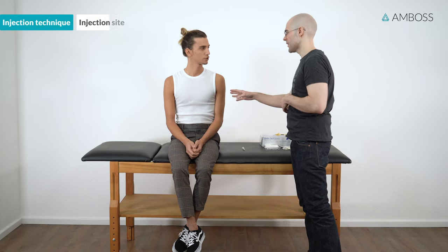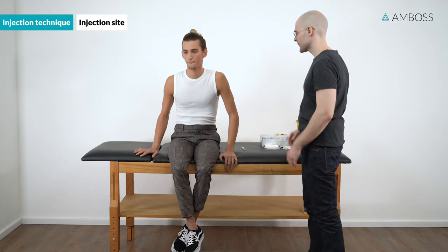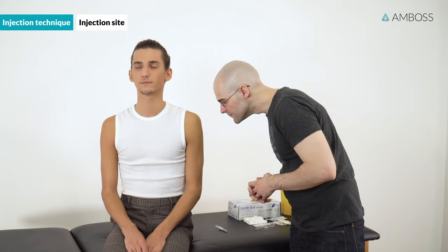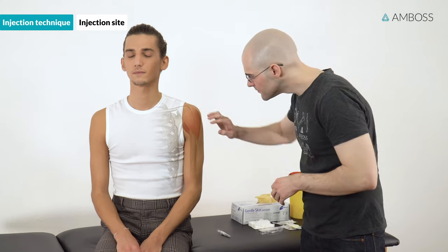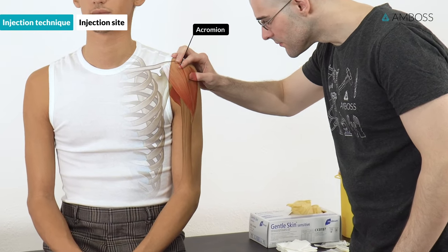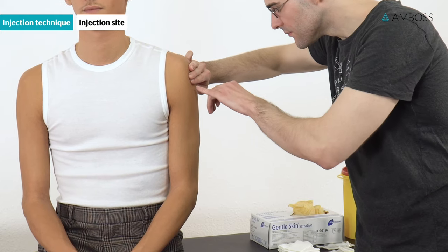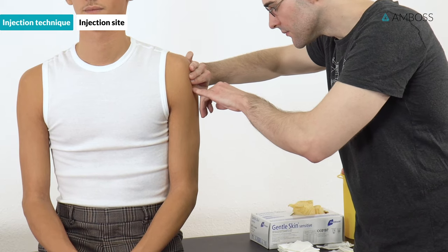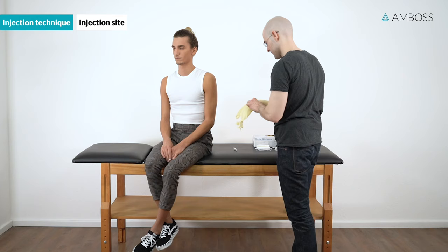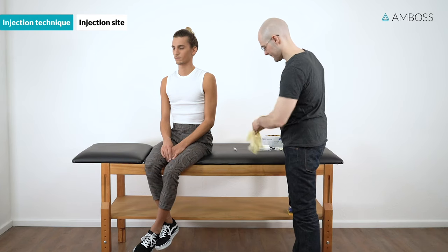It's best to seat the patient in front of you with their arms relaxed at their side. Vaccinate the patient's non-dominant arm — for example, into the left deltoid muscle of a right-handed patient. Palpate for the most muscular part of the deltoid, typically located about three fingers inferior to the acromion. Disinfect the selected area, and the injection site should be completely dry before injection.